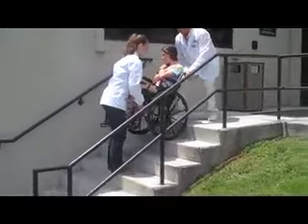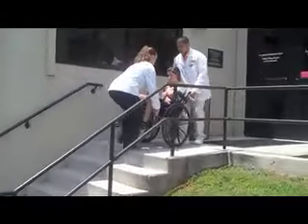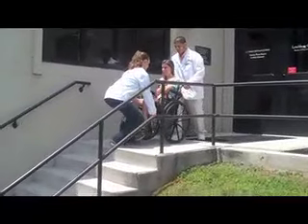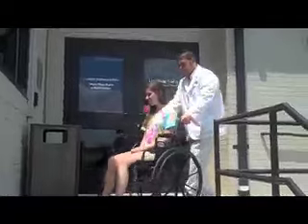When at the top, the wheelchair is rolled backward until the casters are clearly above flat ground. Carefully lower the casters back to the ground using controlled body mechanics. Secure the wheelchair or continue transportation as needed.